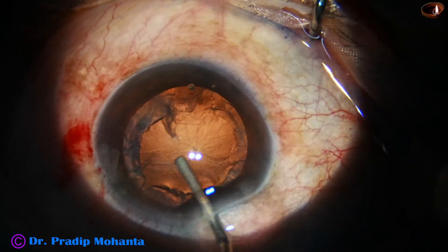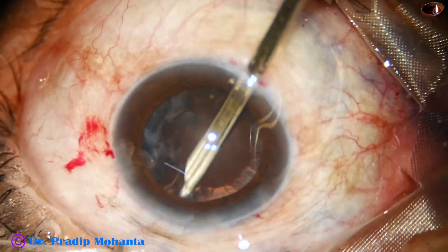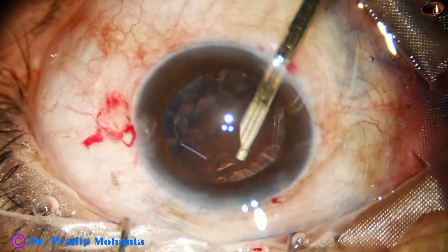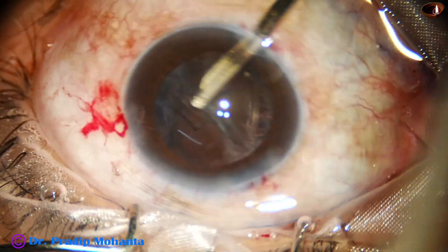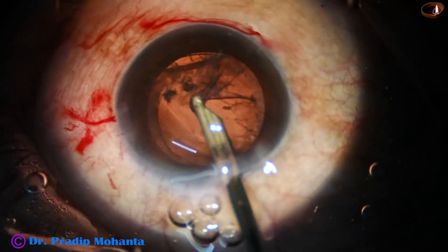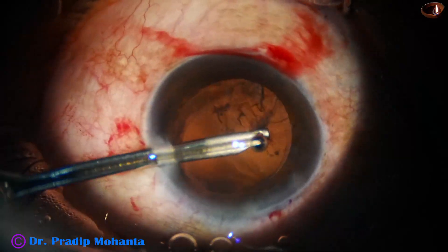The capsular bag is filled with viscoelastic substance and now we have to start removing the cortex. I make a side port at 7 o'clock and start cleaning the cortex from the superior aspect because there is no zonular dehiscence in this area. Start cleaning the cortex from the area where the zonula is intact — the zonula is strong. Finally, you remove the cortex from the area where the zonula is weak. Though you have supported the bag with CTR, always remove the cortex first from the area where the zonula is intact.